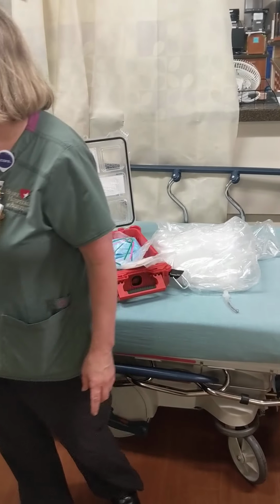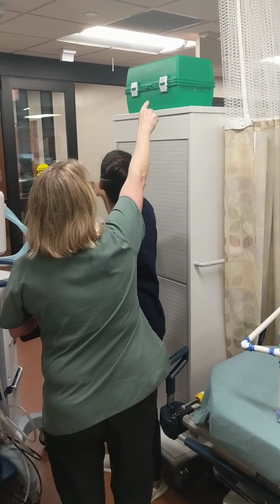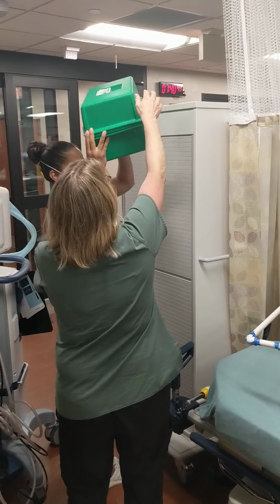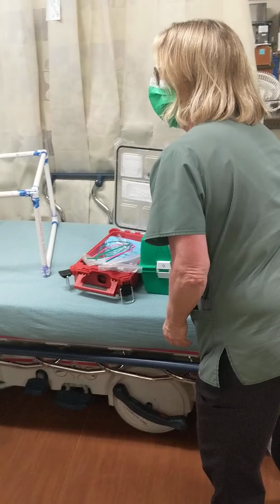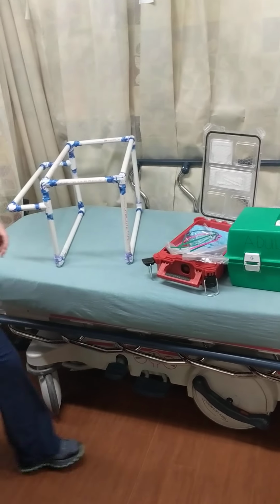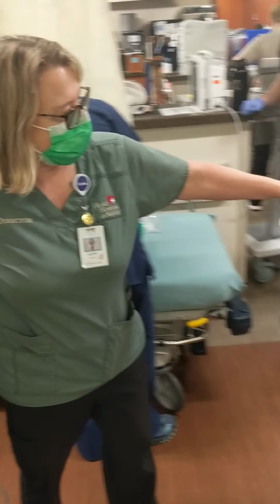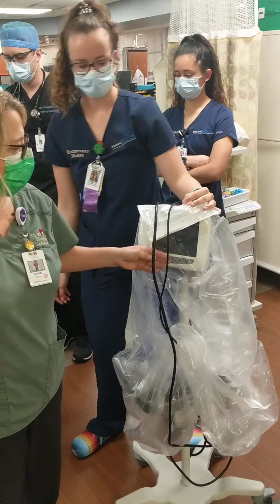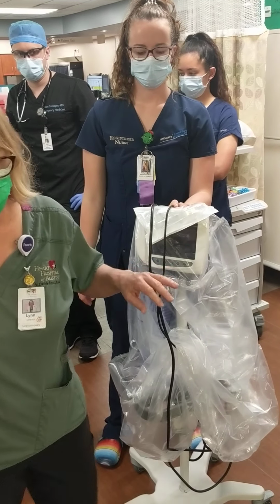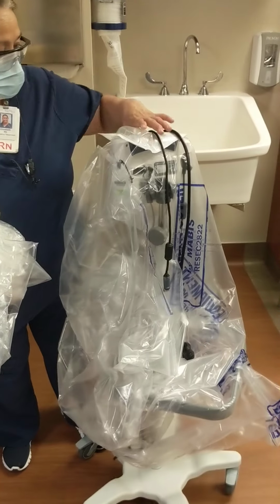So for the respiratory therapists, there'll be two. One is going to grab our airway box up here and get out what we need. Dolly, you're my second therapist, aren't you? Yeah. The primary therapist is going to grab the ventilator. The tech is going to come with the glide scope. On the glide scope, we're going to have the plug and the line out along with the blade, because the plastic cover is going to protect that from exposure.